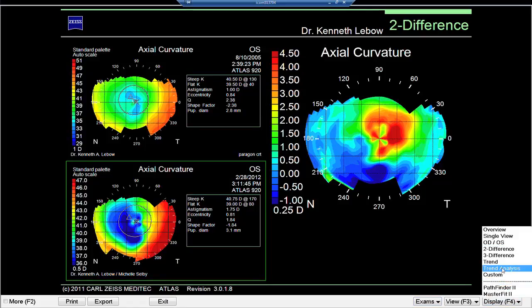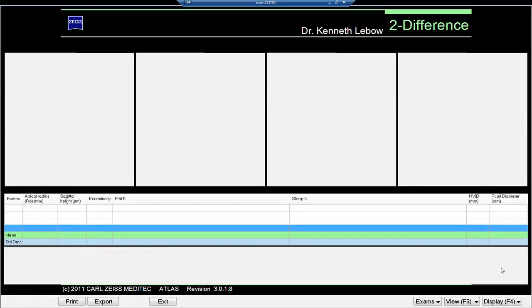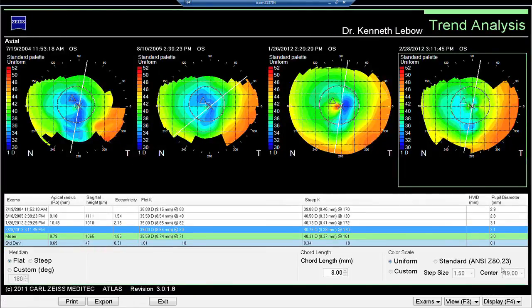Another very valuable map is the trend analysis map. If you're fortunate like I am to have patients come to you for many years, you really want to know over time what is going on. This map shows four different images — the first one on the left is 2004, all the way up to 2012. You can pick the images you want, and it demonstrates a long-term view of the health of this particular eye.